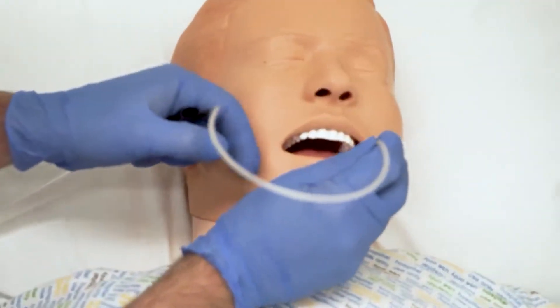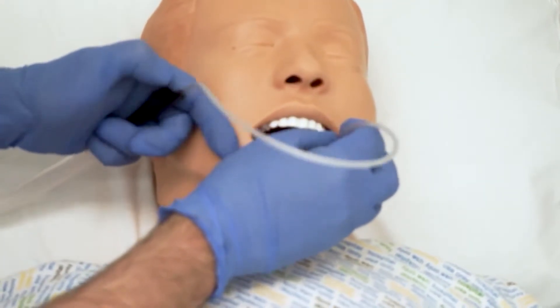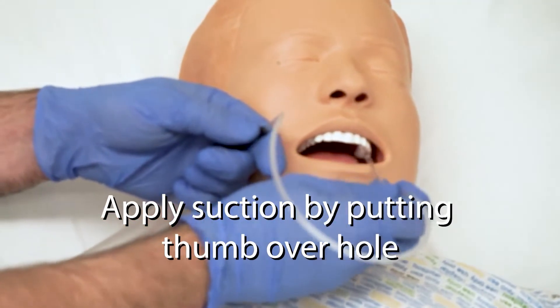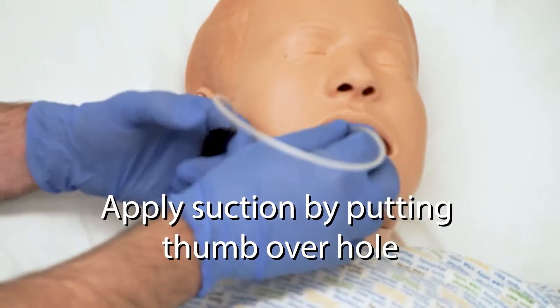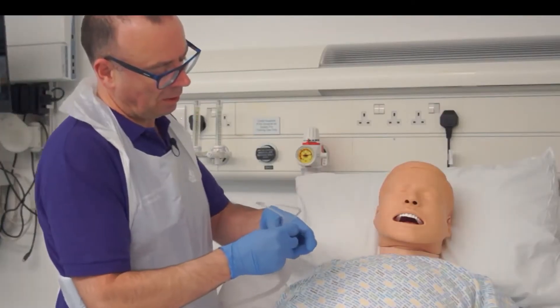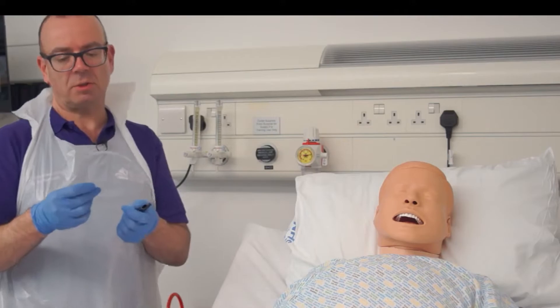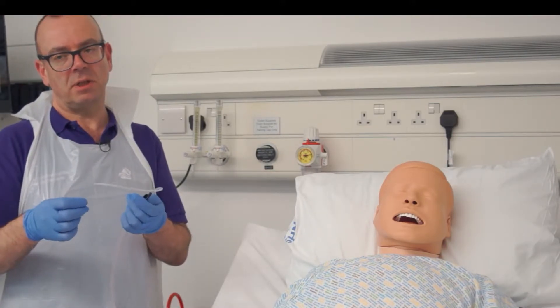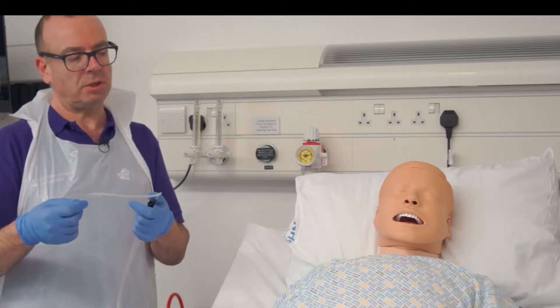We can gently introduce the catheter down into the sides of the mouth and we're going to apply suction on the way back out, noting what we're removing from the patient's airway. The other option, because they're soft and flexible, is that we can pass it through the nose and into the nasal pharynx and encourage the patient to cough.